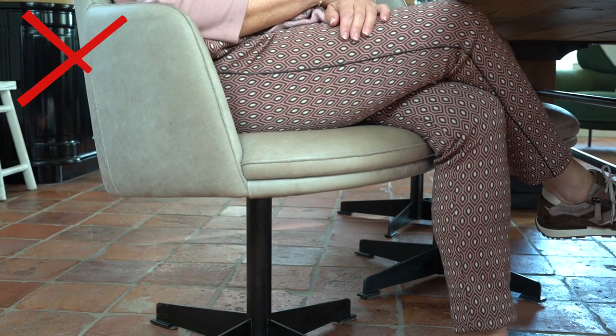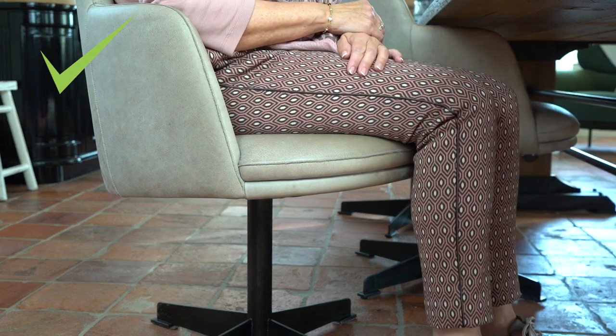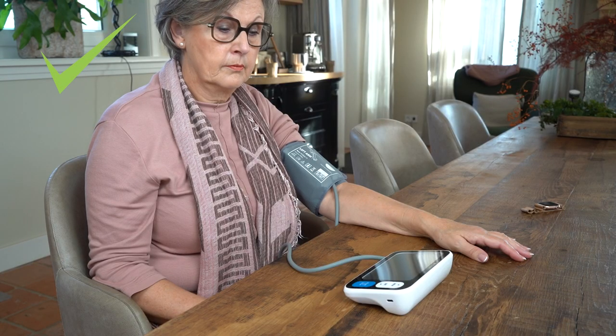Remember, readings can be influenced by small details. Do not cross your legs while taking a measurement. Do not talk during measurement. Don't take a measurement when you need to go to the bathroom. Sit with your arms straight on a flat surface.